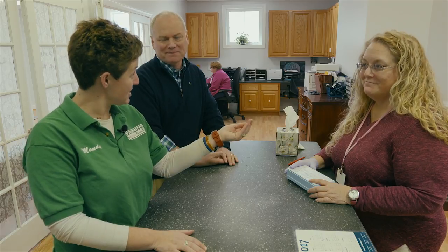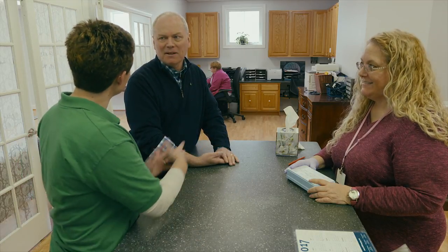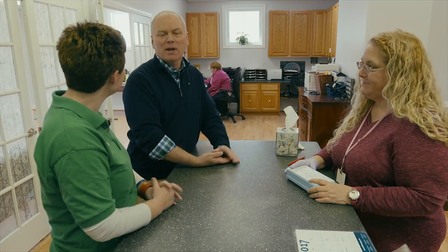Okay, so one of the procedures that does take place at an allergist is skin testing. And Dr. Gels himself is going to do some testing as well with his certified allergy technician, Tara. And we're gonna see what you're allergic to. So explain what happens here, sir. So as you said, an important part of evaluation for somebody's allergies is to be tested. And we do skin testing, which is readily available. The first step in skin testing is prick testing.